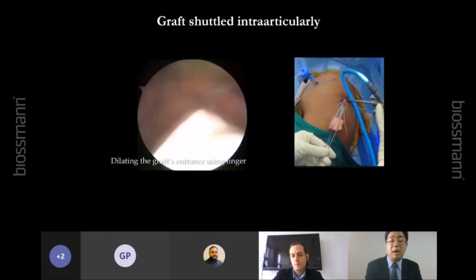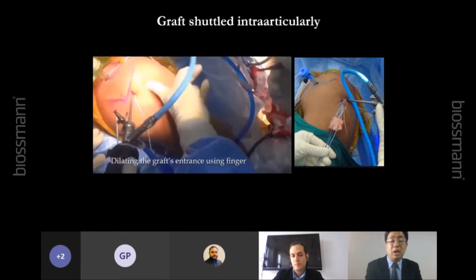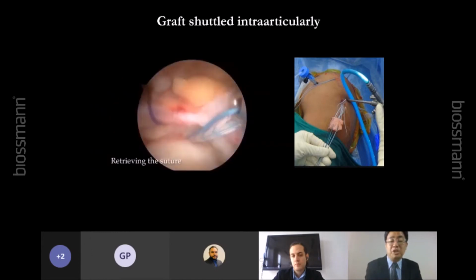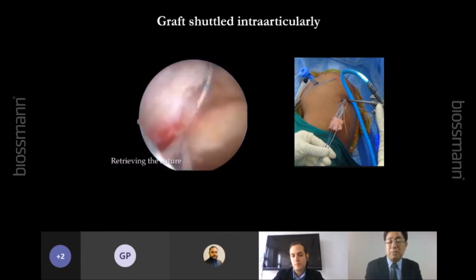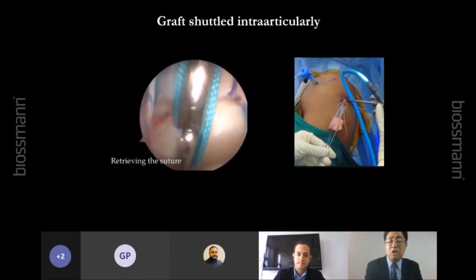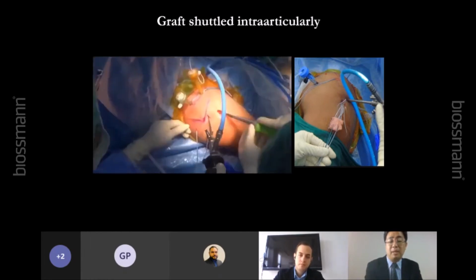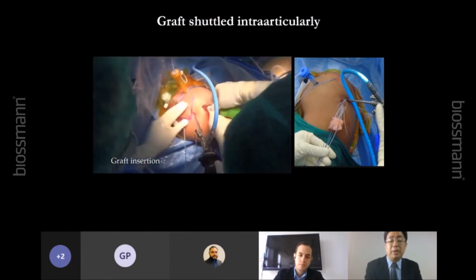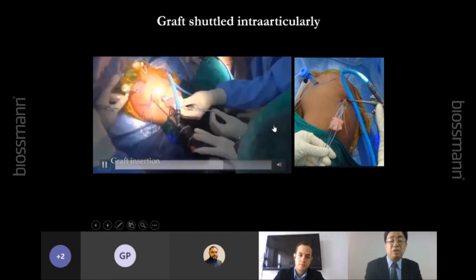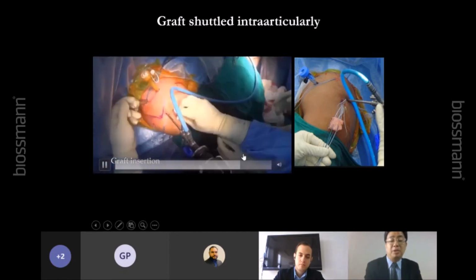Then we pass the graft. I use my finger to dilate first. And then we pass the graft into the joint like that. The beach chair position is quite comfortable. I think it's easier than the decubitus position. Then pass the graft in, like that. And then we make a knot tying. So we pass this graft in.